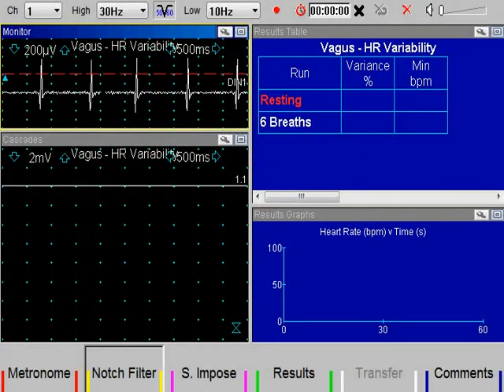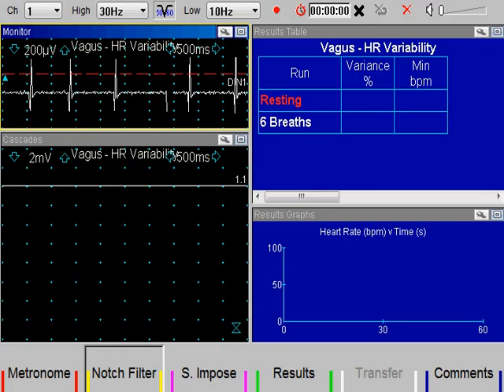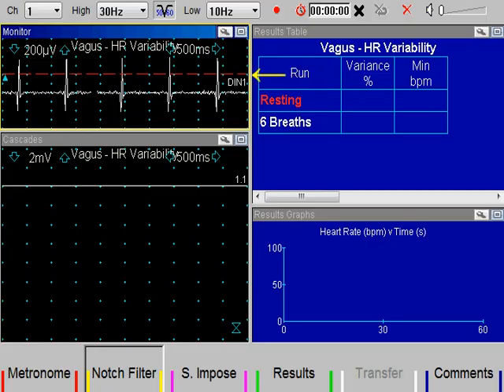Heart rate variability or R-to-R interval analysis. Connect the recording electrodes to channel 1 inputs of the amplifier. The ECG is displayed in the top window. The horizontal red line is the trigger level. Adjust the level for optimal triggering.